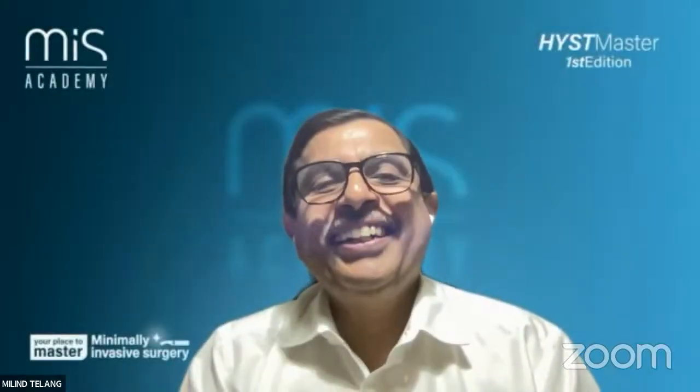So I think you have given wonderful tips and tricks. And the most important thing that you have spoken about is pre-hysteroscopy imaging and proper evaluation of the patient. Sometimes you have a focal thickened endometrium. It may be just a thickened endometrium and not a polyp. So you have to evaluate the patient properly.